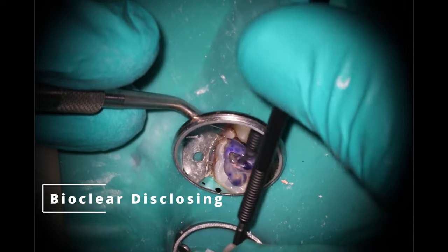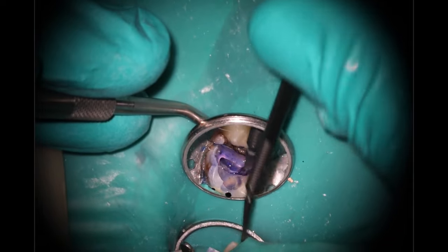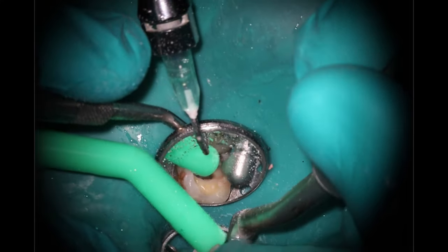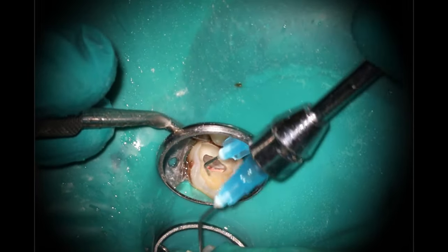We've now got the bleeding to stop, so we'll go through the normal BioClear process. The disclosing solution — she's handing that to me. It does stain, so you want to be very careful when you're passing it back and forth; I've gotten in a lot of trouble for leaving it in places that I shouldn't, because it stains everything. At this point I'm going to go over — we have swapped mirrors. We use the larger size 4 mirror because I don't care if these get scratched up; they're a little bit more resilient. Jenny's in there with the air as well as the suction. The blaster goes everywhere, and that mirror is large so it's really hard to keep it clean, so I just focus on one area so the doctor can see.